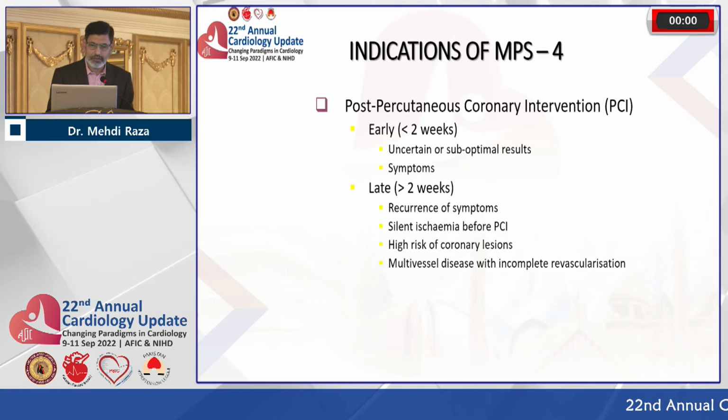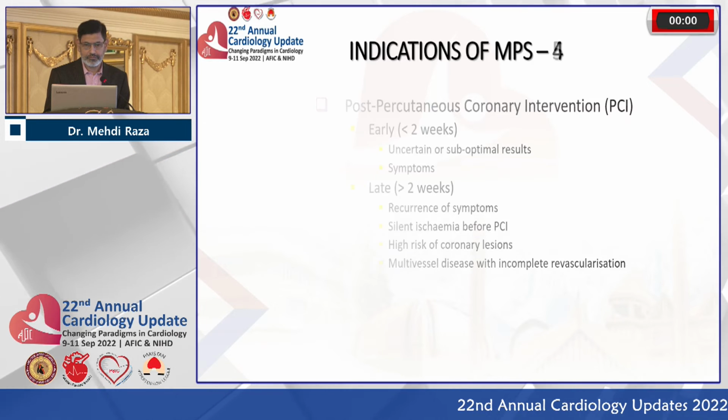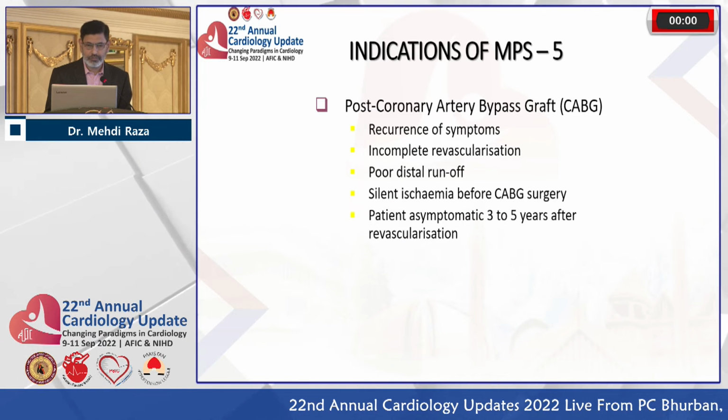This is post PCI, earlier on or later. This is post CABG.